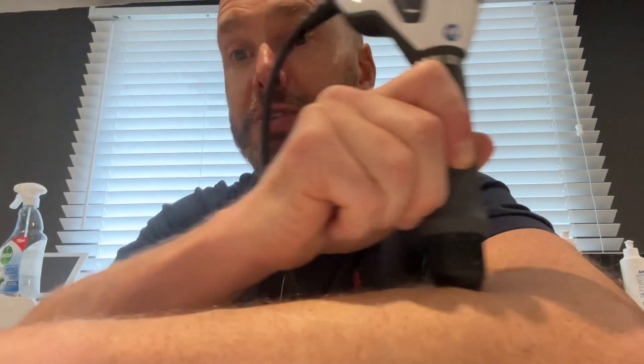The next thing is speed, and this is a big one. I see people zapping up and down very fast over an area, and I see people completely stationary not covering very much. You want slow and steady — slow and steady wins the day. If you're doing 12 shots a second, you can still move the applicator and cover a huge volume of shockwaves into that area. Going up and down too fast, I don't think very much is happening.